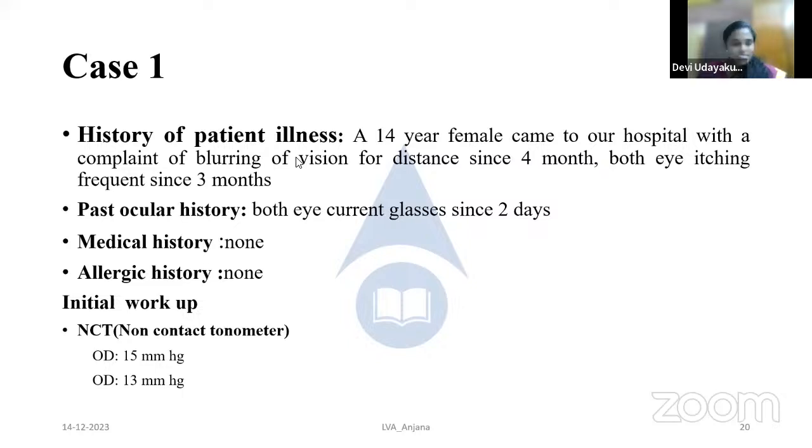So the next point which I had about the refraction. When you are evaluating the refractive error, when it comes to low vision, in my practice I have seen that auto refraction hardly gives a value. So we always use our retinoscopy. Our retinoscopy gives the best results. But yes, you can try auto refraction. But regular retinoscopy will give you good information. And if the regular retinoscopy is not possible, go in for the modifications which you can do with the regular retinoscopy, like radical and off axis and all. So this is one point which I wanted to highlight here.